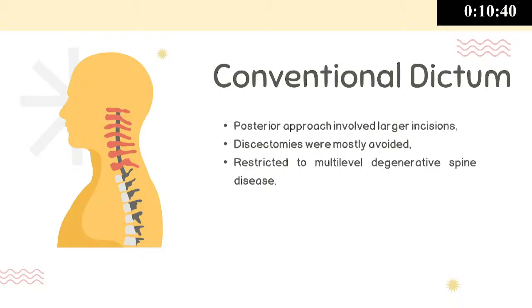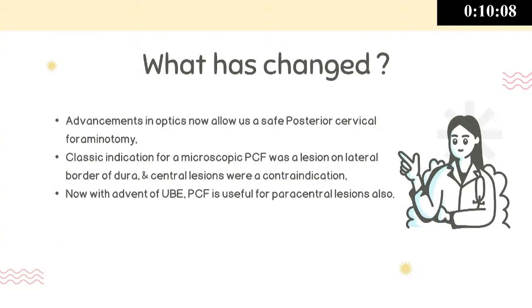The conventional dictum was that posterior discectomies cannot be done because, of course, we understood the anatomy. The cervical roots go out straight in this way. There is no shoulder. There is no concept of a shoulder when we talk about a cervical root. There is only the axilla, and the axilla can only be exposed if you have done a medial pediculectomy. You have to perform a medial pediculectomy, because if you don't, you will not see the axilla, you will not see the root over there.